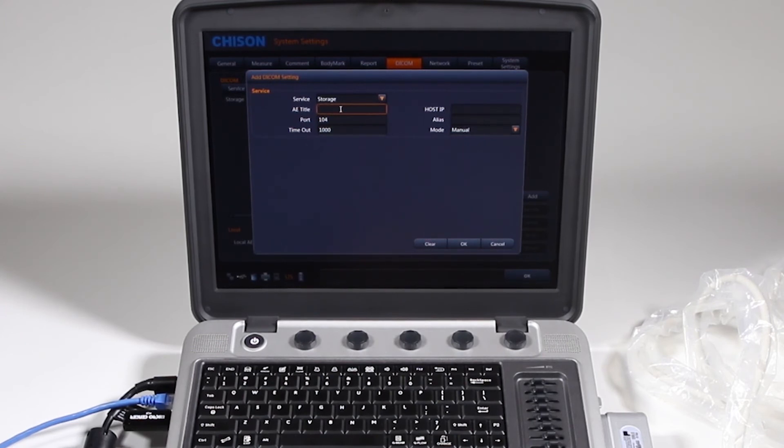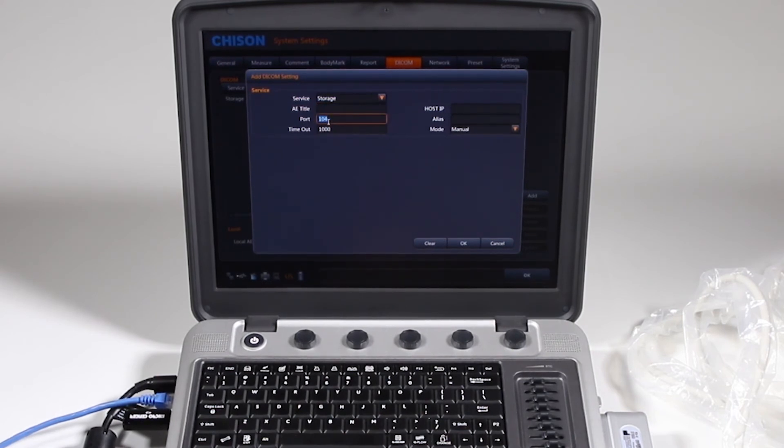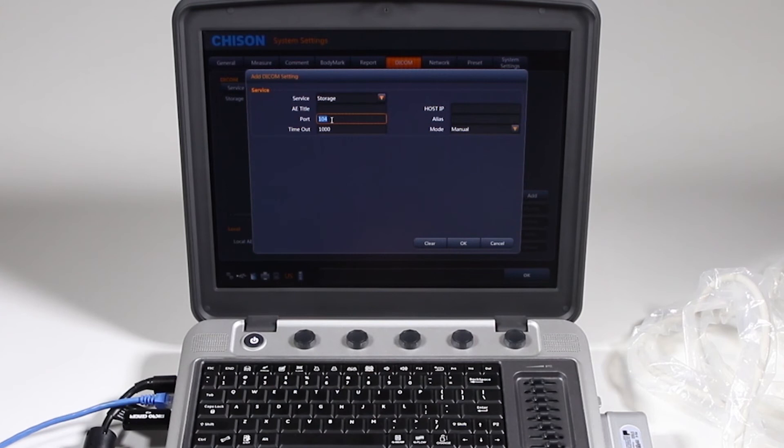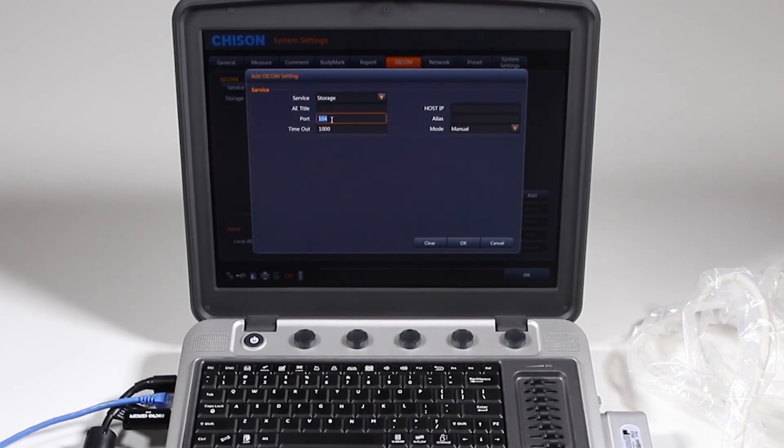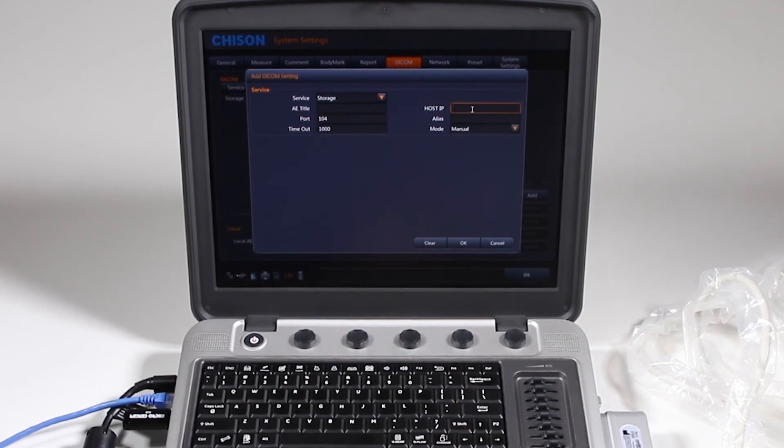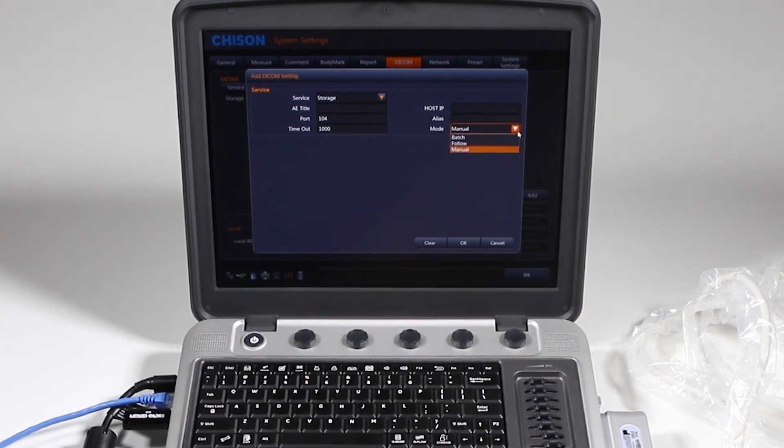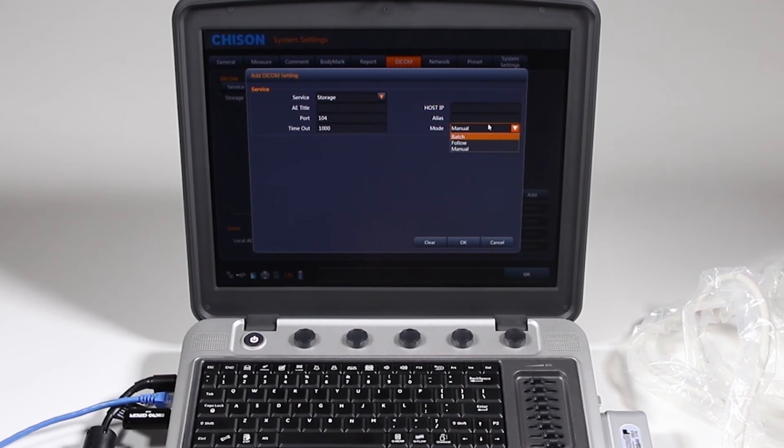One of the most common problems with setting up DICOM are people do not look at the AE title correctly. Next most common problem is to not give it a correct port number. If you are not given the exact port number, it won't be accepted by the DICOM server. Leave the timeout as a default. Host IP, then type this in exactly as given, and you may or may not need an alias. This manual is when do you want it to send.